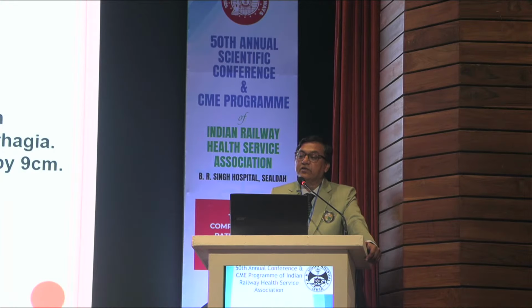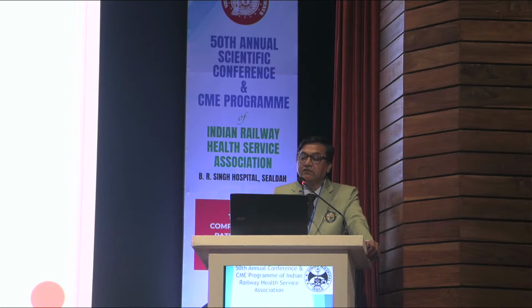Another case is the intramural uterine fibroid. We never thought that we would be able to do a myomectomy with proper suturing and little blood loss with the laparoscope. But we could do it. A 30-year-old patient with 1 child came with a complaint of pain in the lower abdomen and menorrhagia. USG revealed a large anterior wall fibroid, 8 centimeters. Lap myomectomy was planned. This is the fibroid, an old picture.